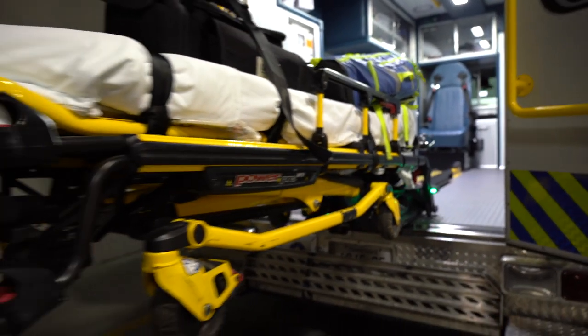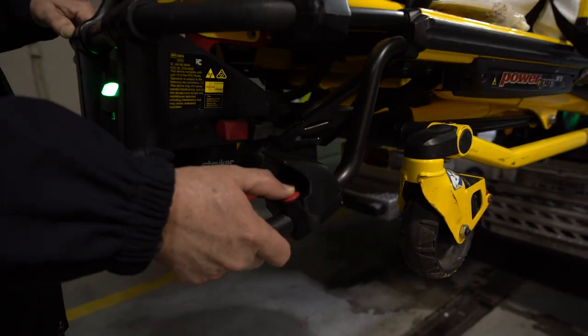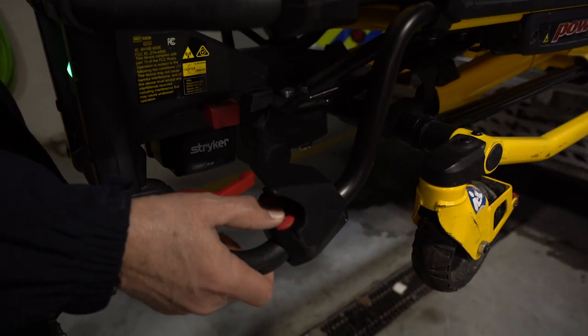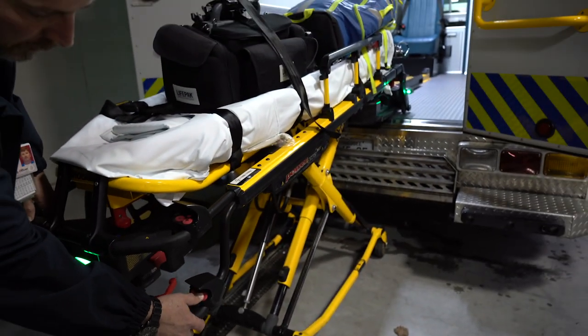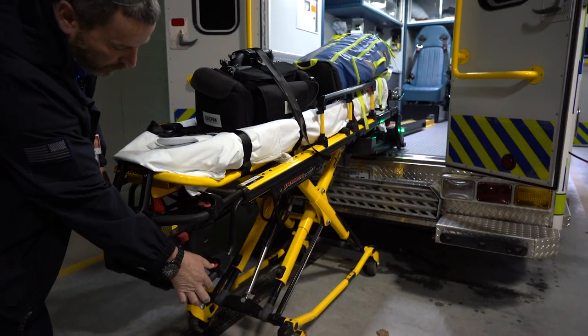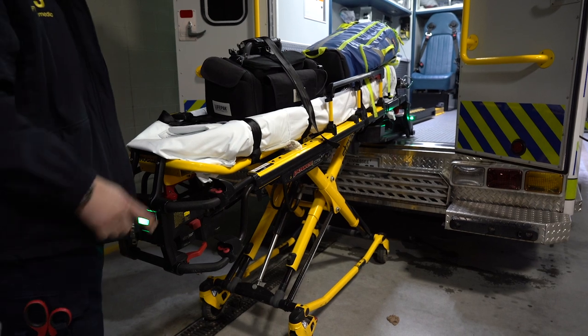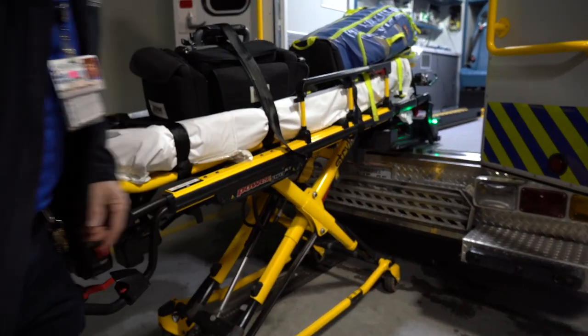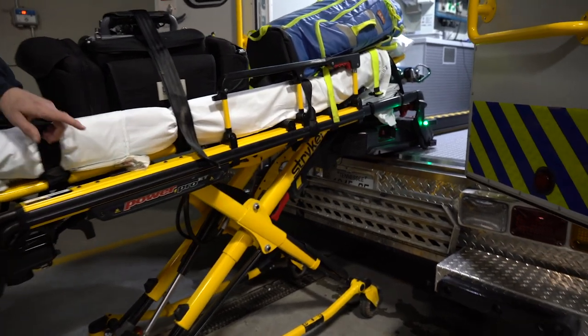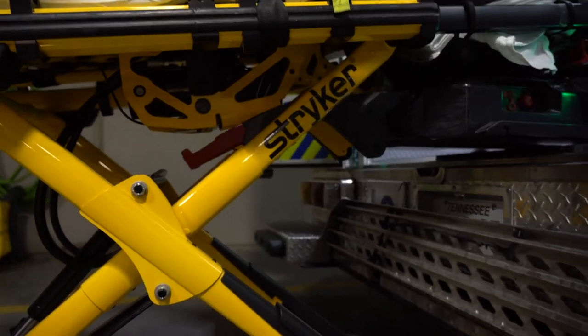Then we push the positive button on the handle to make sure that the stretcher goes down. You can use the upper one or the lower one — they both work the same. You have to continue going until the levers at the very bottom come up. If you push the negative button, it'll come back up.